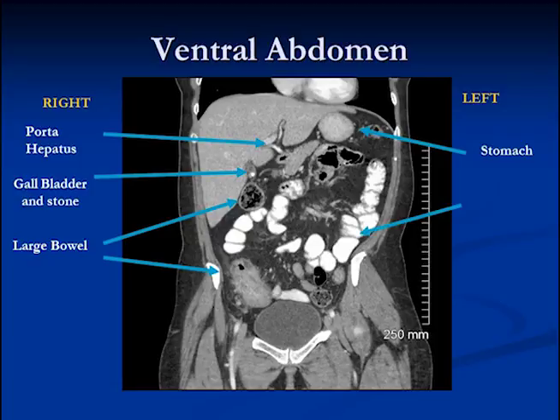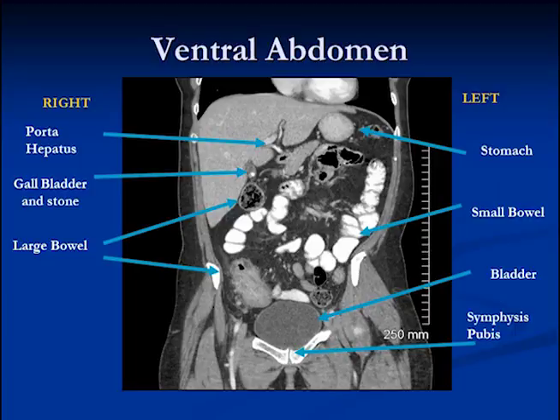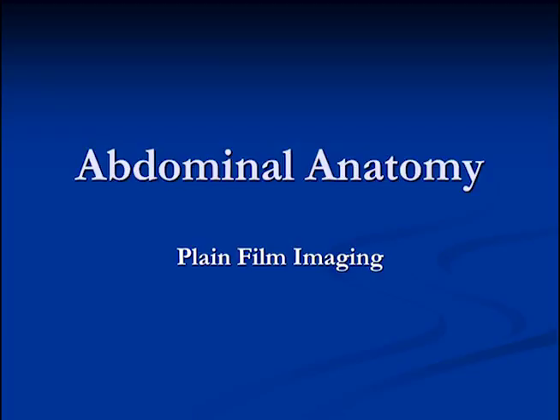So that's large bowel there. We have the small bowel which contains contrast media, and finally below we have the bladder. All these structures are easily seen on these coronal images. This is the symphysis pubis and the femoral artery, right in front of the hip joint within the muscles.